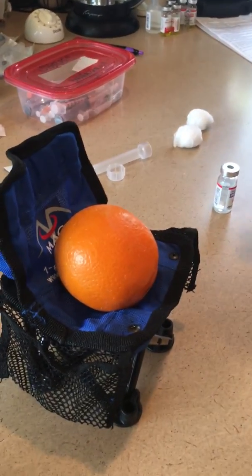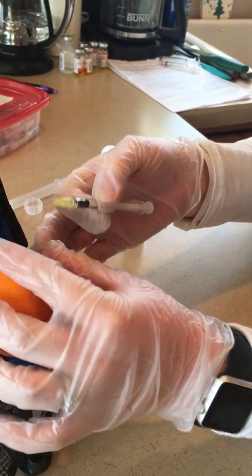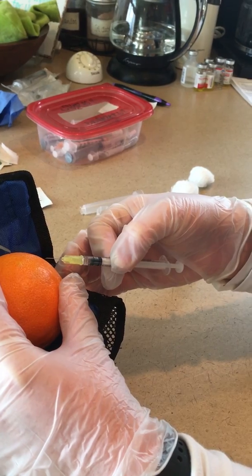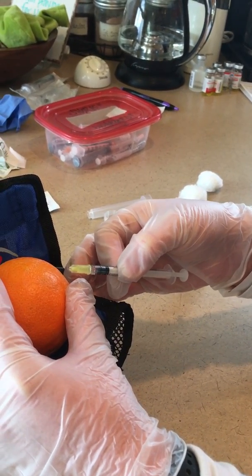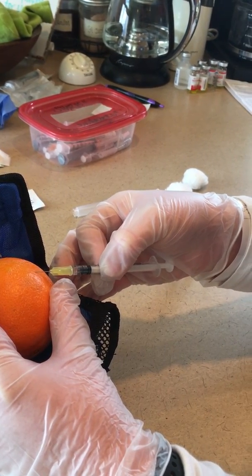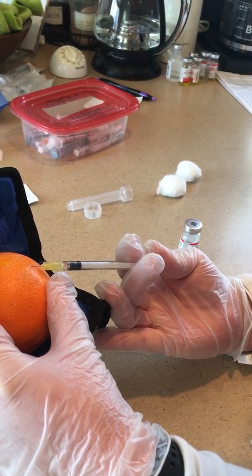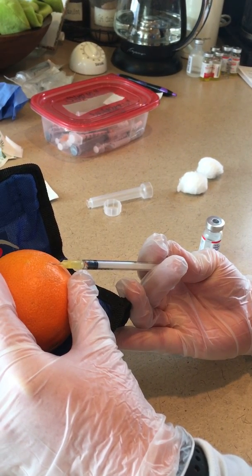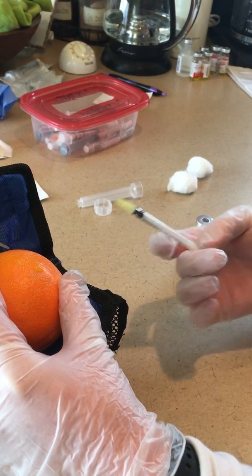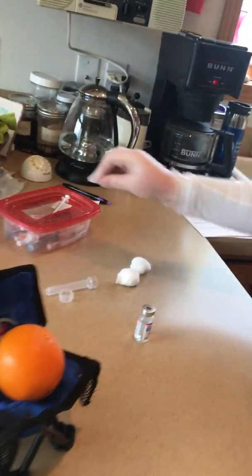I'm going to very gently, with my non-dominant hand, make sure the skin is taut. At about a 10-degree angle, between 5 and 15 degrees, I'm going to insert just about 1/8 of an inch so that the bevel can be seen just under the surface of the skin. About like that. Then I'm going to inject the 0.1. Okay, I'm going to release that, and discard into my sharps.